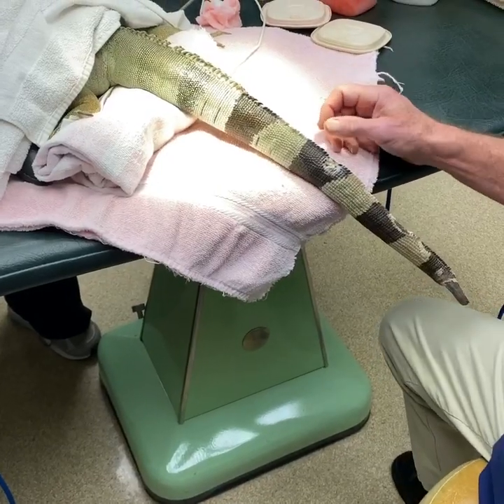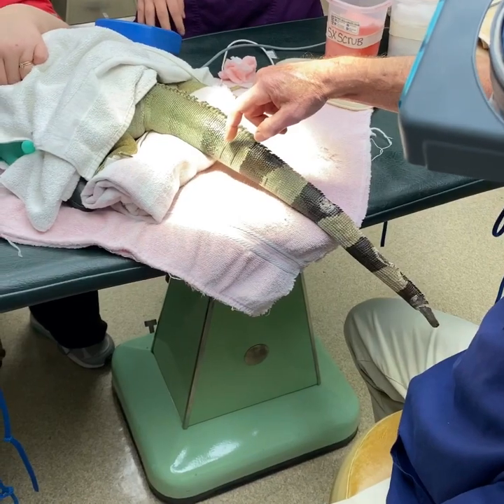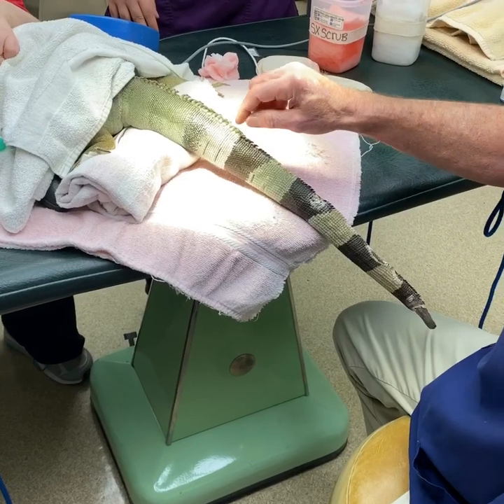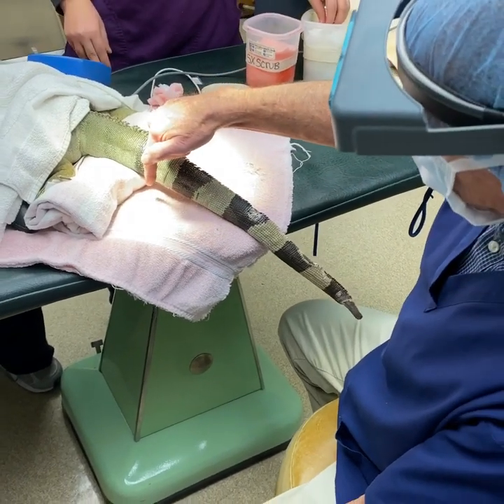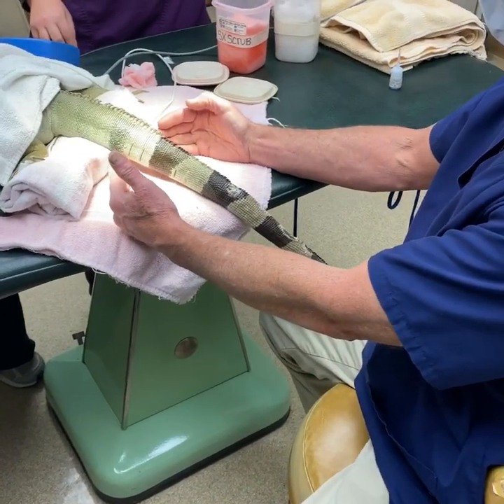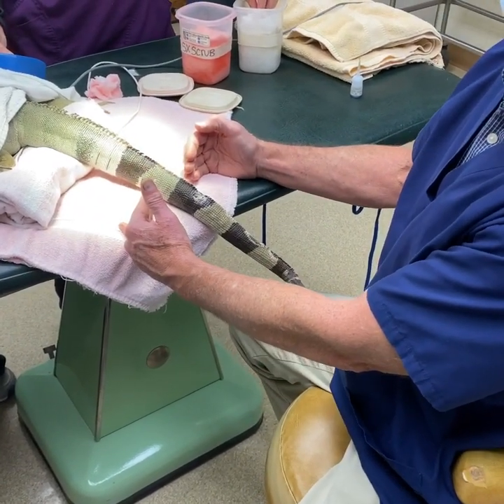We've marked the tail here in three sections, which we will show you on the radiograph as to why. The incision will be made on this most proximal line where we know we have healthy tissue versus diseased tissue further distally.